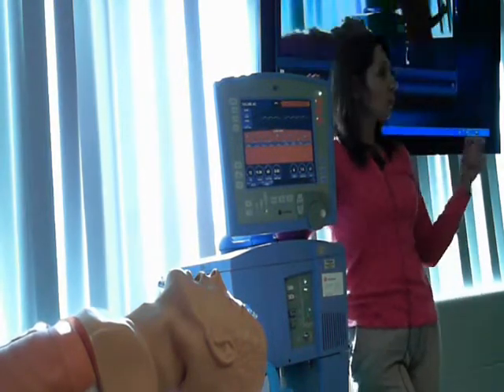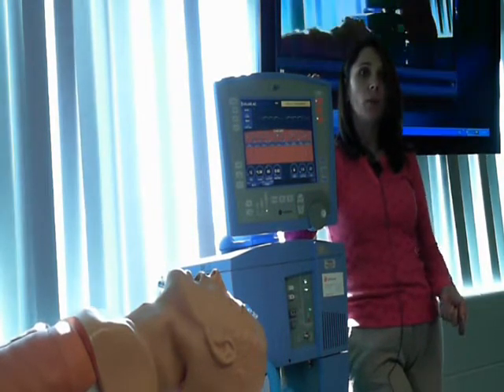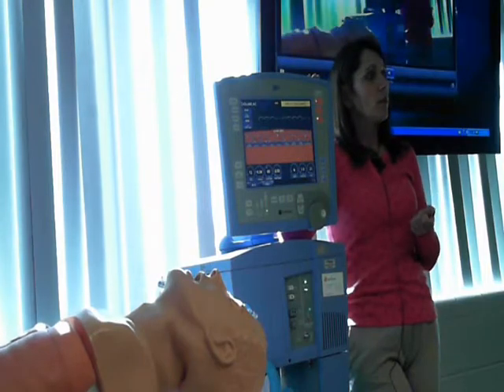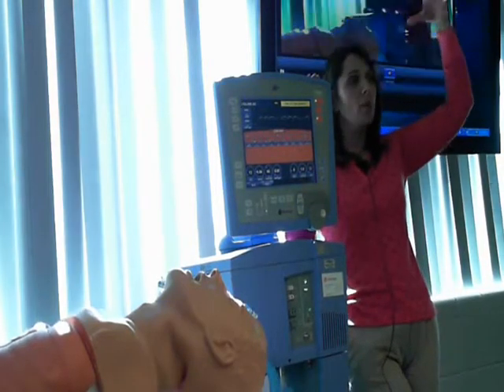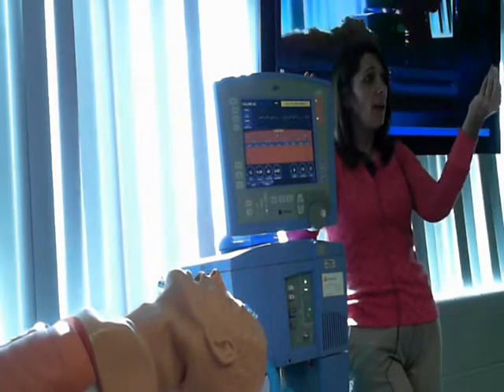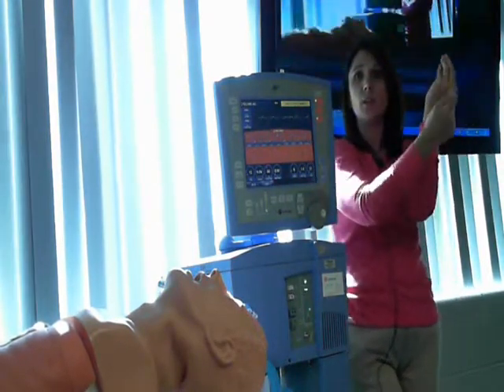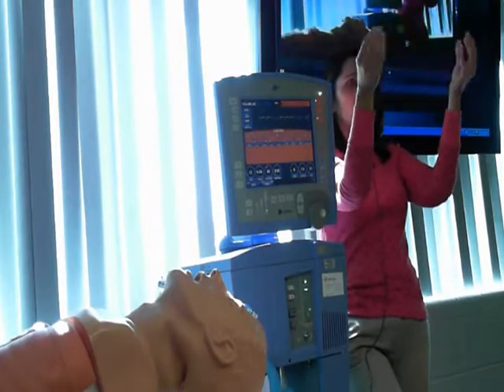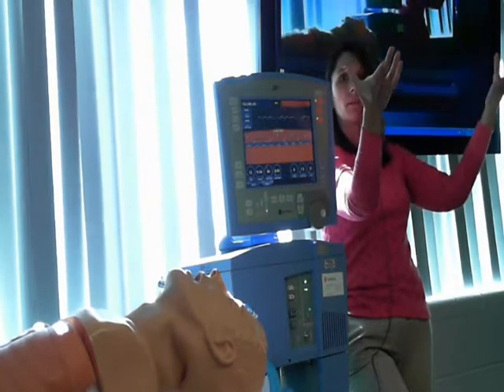The reason you use it is to recruit the lung to improve your patient's oxygenation status. So here is what happens with some disease processes. We can put this ventilator all the way up to 100% oxygen. But if the patient's alveoli are collapsed, is the oxygen going into the unit that can diffuse it into the blood? No. So positive end-expiratory pressure is a continuous pressure that goes down through the tracheobronchial tree all the way down to those little alveoli and pops them open.